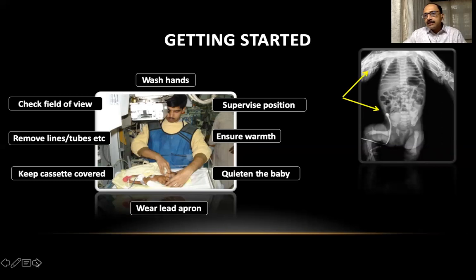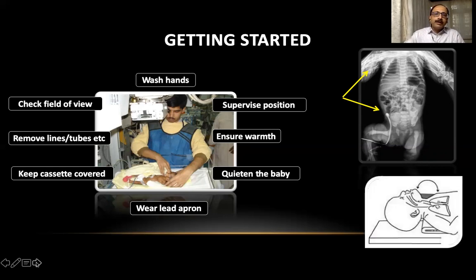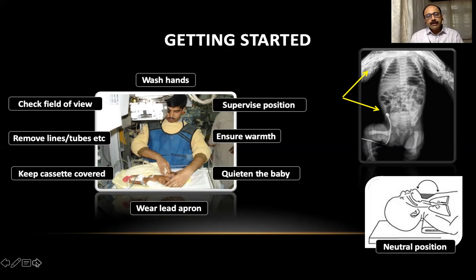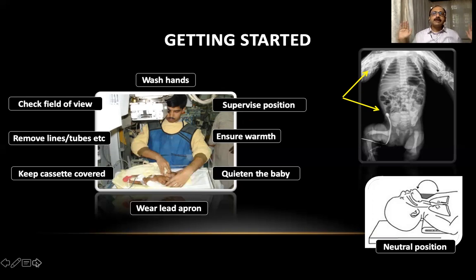What you also see is hands getting across the field of vision — again, that's not a good way to shoot an X-ray. Attention must be given to the position of the head; we want the baby in neutral position with the head in sniffing position. Flexion will push the endotracheal tube down; extension will pull the endotracheal tube up; and if you rotate the baby's head to one side, it will cause the endotracheal tube to move up. We need to ensure the baby's head remains in neutral position. Lifting both hands of the baby up may indirectly lift the chest, giving rise to lordosis on the X-ray. A better way would be to keep the hands in the sideways position.